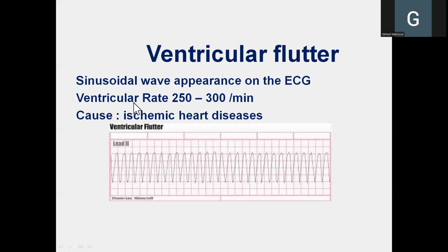And because the origin is in the ventricles, from an ectopic focus that might be on the right side or on the left ventricle, you can never know. But it is an abnormal ectopic focus. And by ectopic, we don't only mean that it is abnormal, but ectopic rather means that it is besides or in a position that is not the normal position.